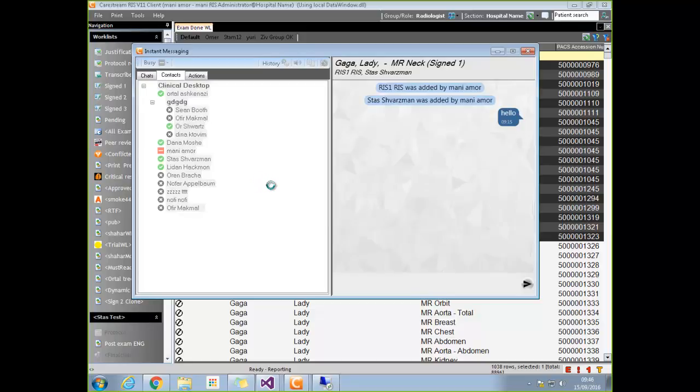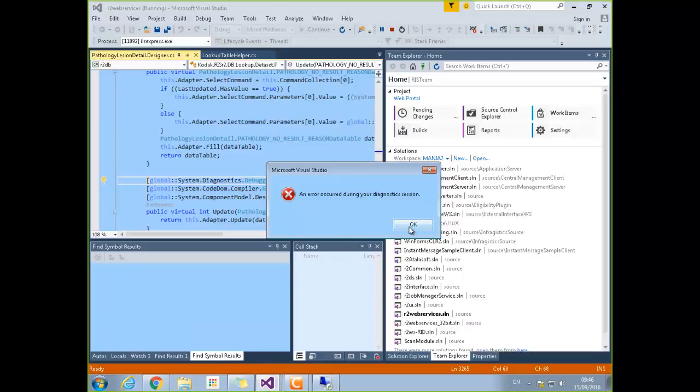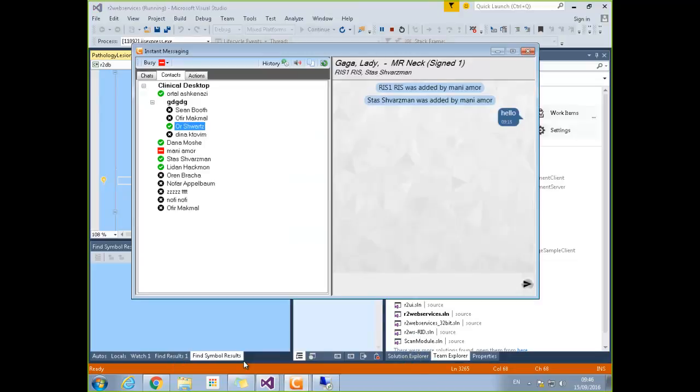Because you want a different display. If you want a broadcast system and you want a whiteboard and you want a list of messages, you also need to associate a different GUI for that. But you want to see it in a similar GUI. Lee told us that you were contemplating having a broadcast. That's a different system. You use the same notification, but it's a different system. You don't want it in the chat. Right. You want notification in general in the list.